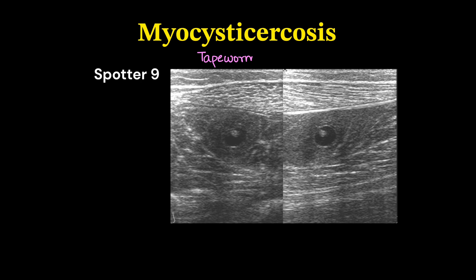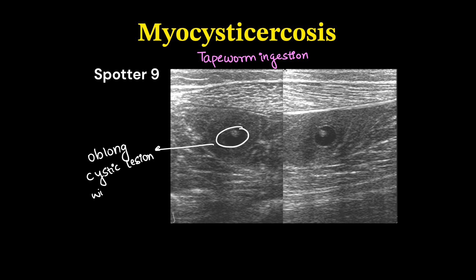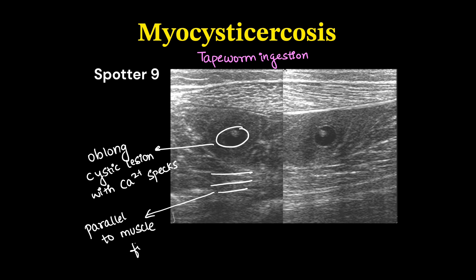This is an ultrasound image of myocysticercosis, happening due to tapeworm ingestion. We can see oblong cystic lesions with a calcium speck. These lesions will usually be parallel to muscle fibers, and the calcified speck is the dead larvae. This is also called rice grain calcification.